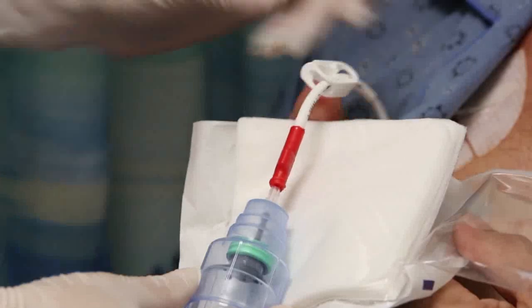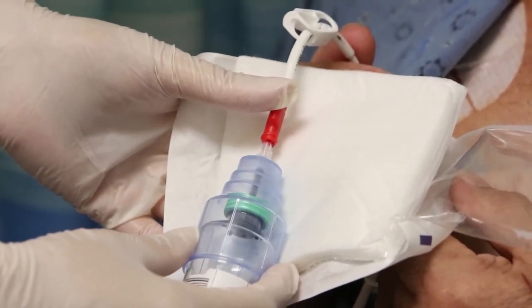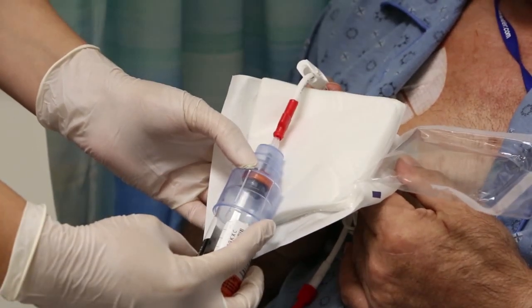Unclamp and insert the blood culture bottles into the vacutainer. There's no need to discard the first few mls of blood when blood culturing via a central line as this might return positive cultures indicating a line infection.